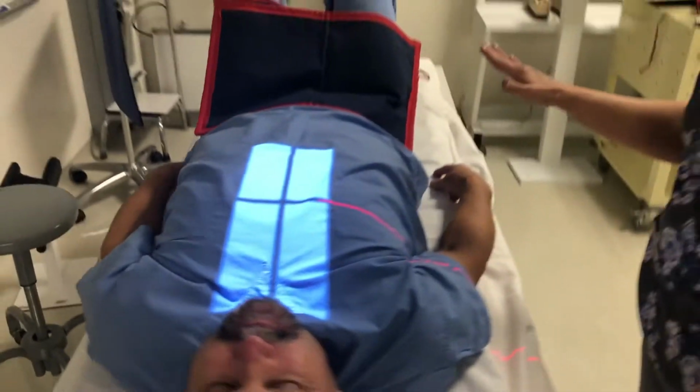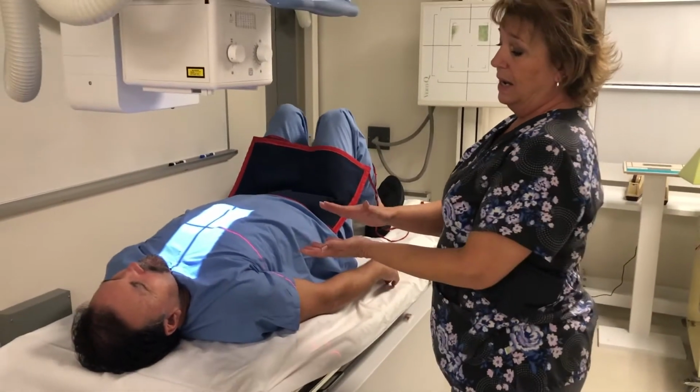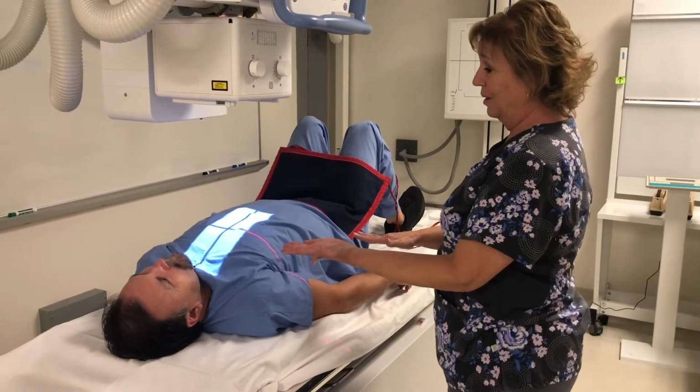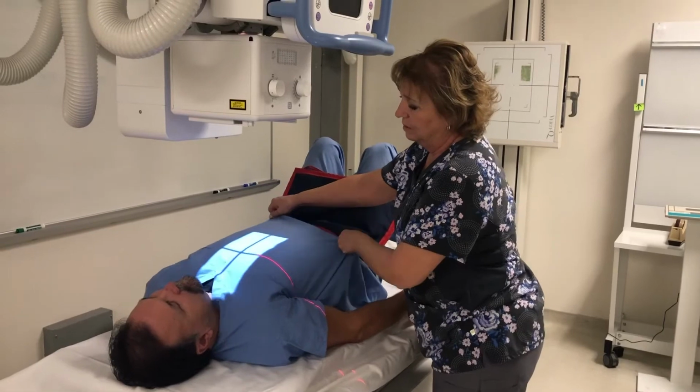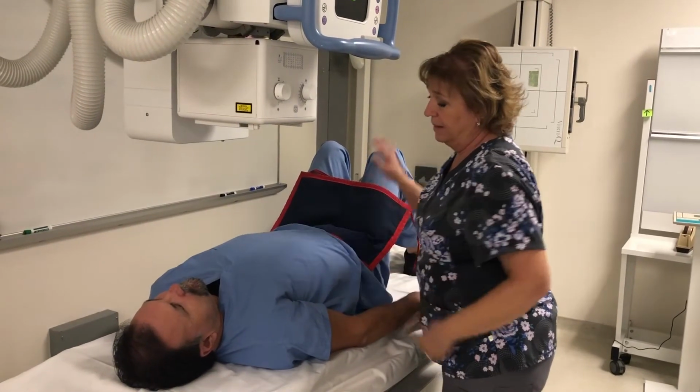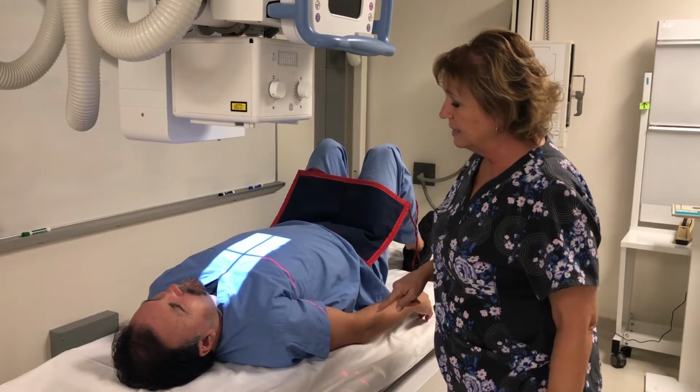Knees are bent again. Not only does it reduce the lordotic curve of the lumbar spine, it also relaxes the kyphotic curve of the thoracic spine. So we're going to have the patient bend their knees. They can be shielded for this.